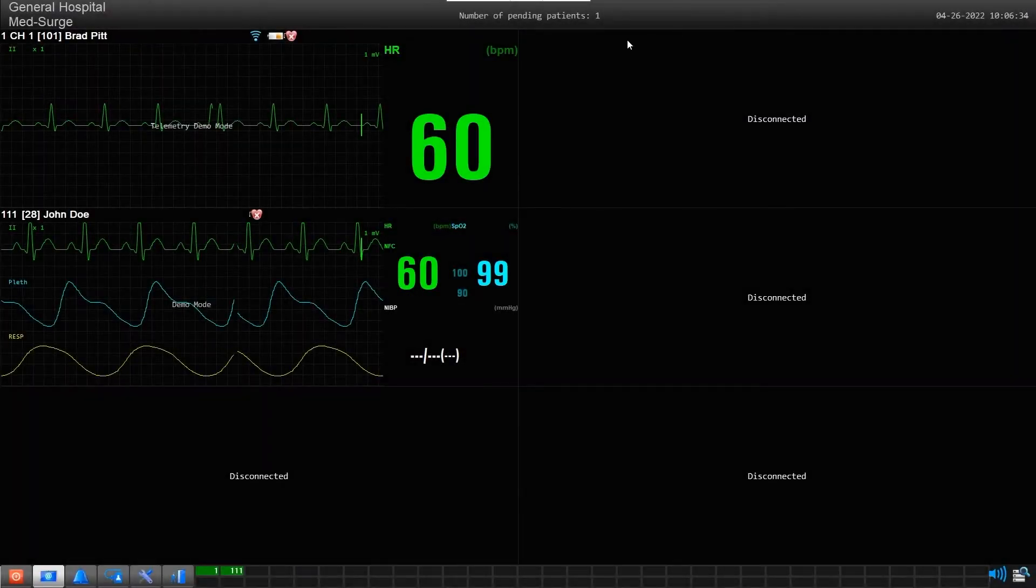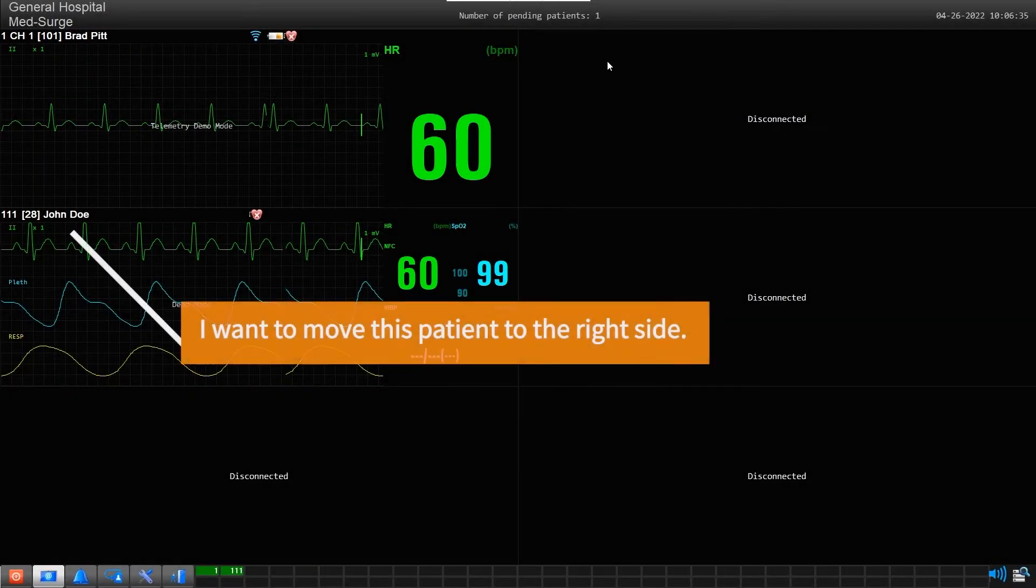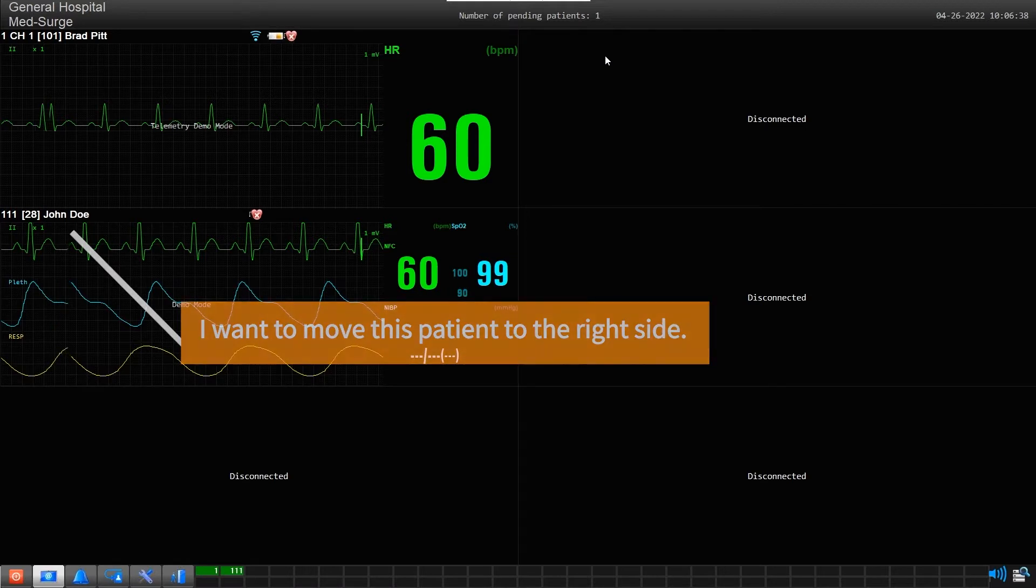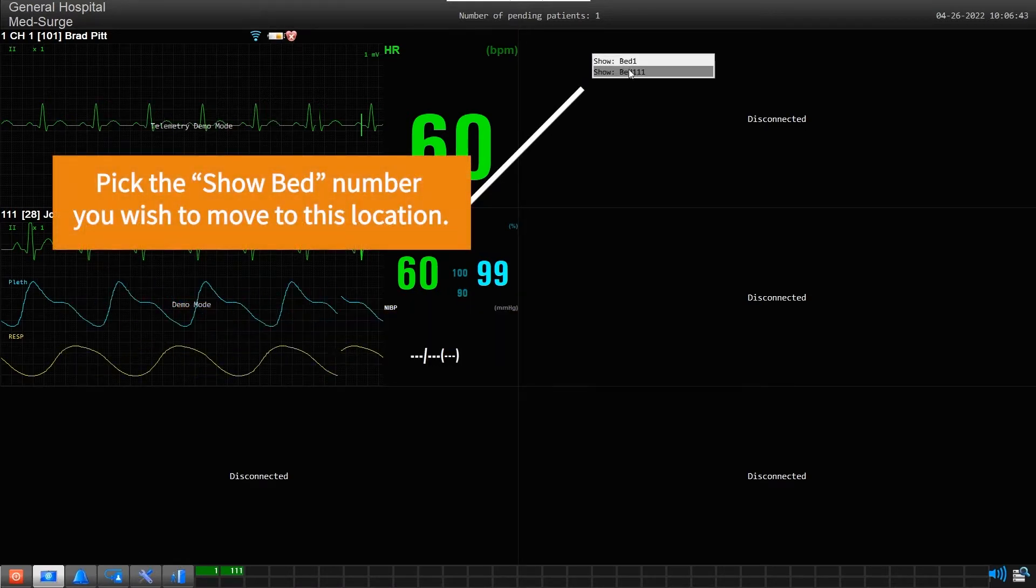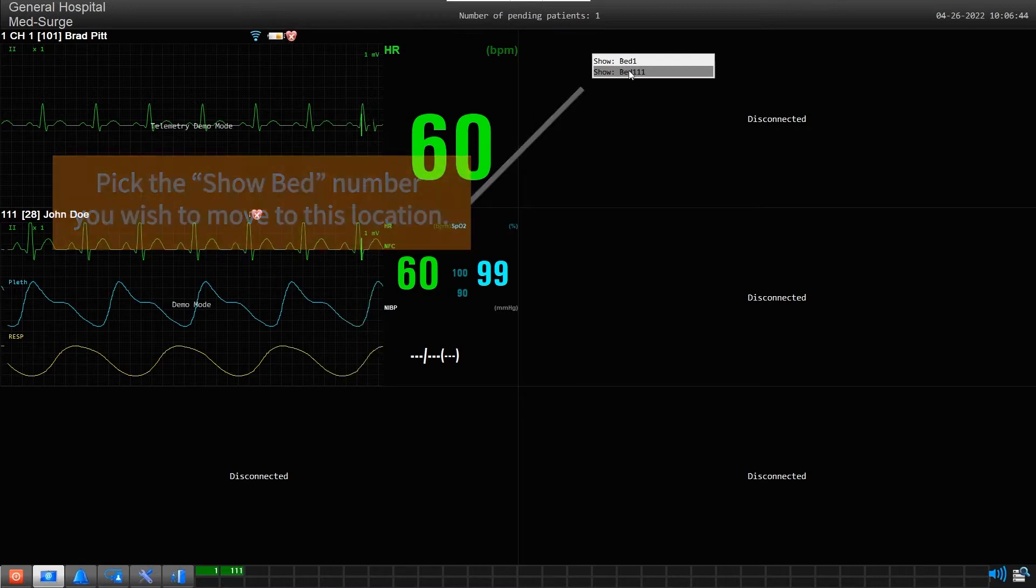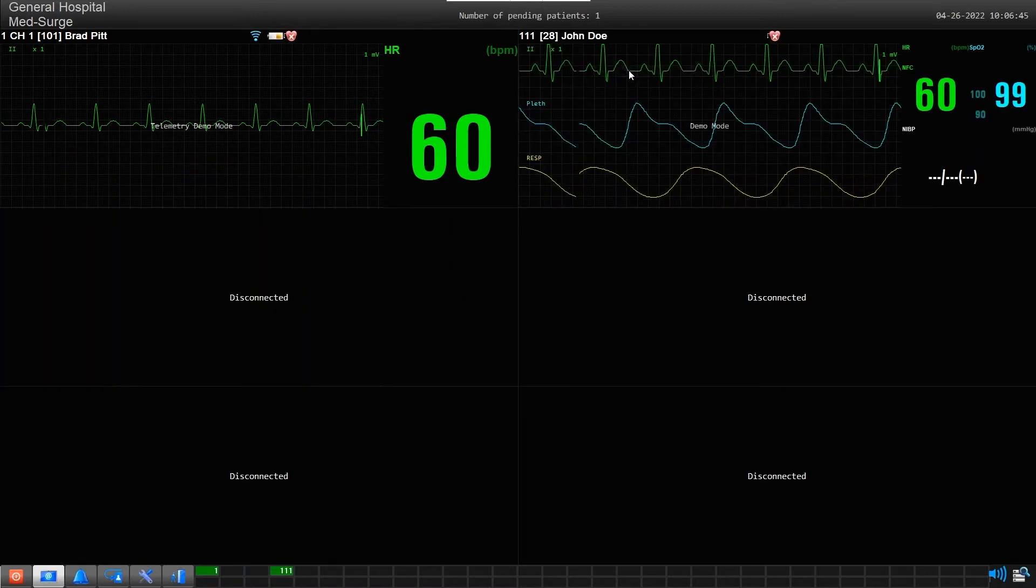For example, if I want to move this patient in bed 111, then I would pick show bed 111 here to move that patient into this slot location. Your patient has now moved to a different screen location.